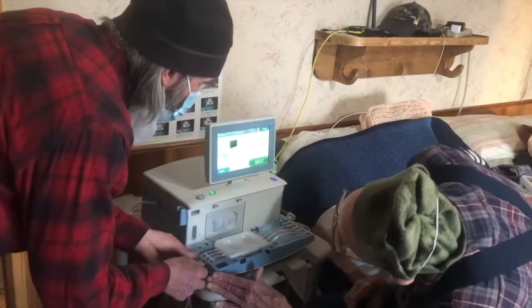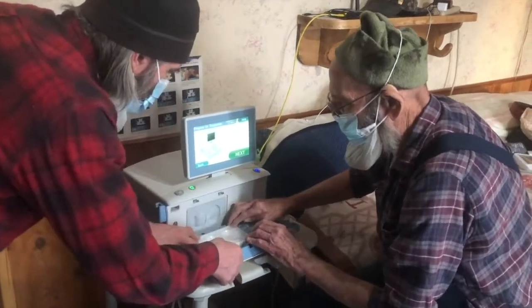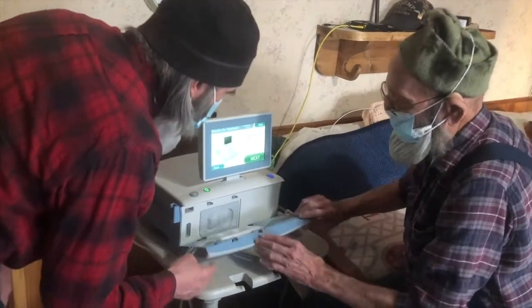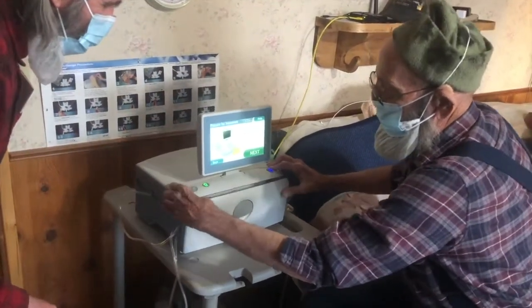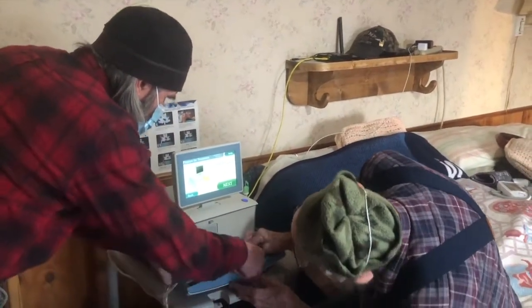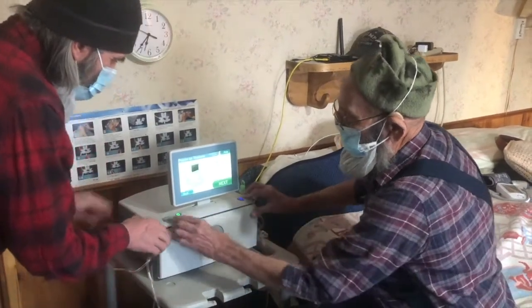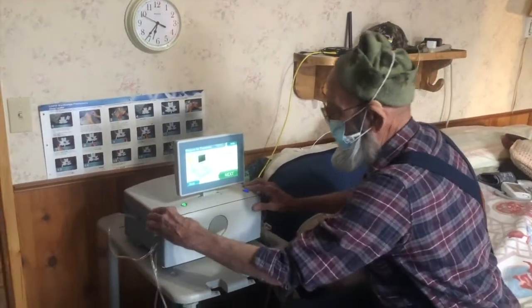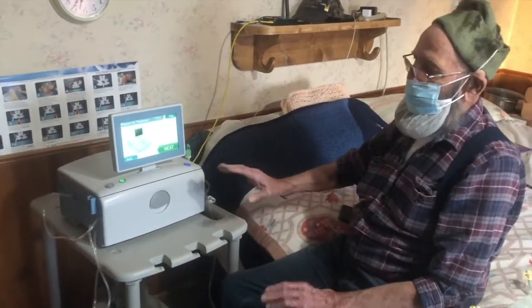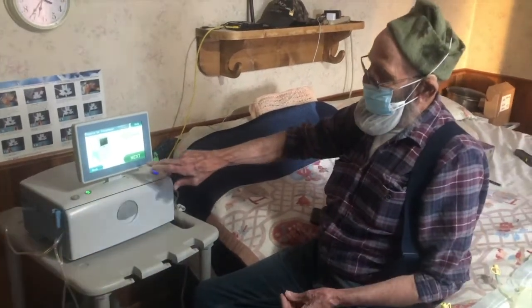No, it ain't gonna shut. And this happens. It's something else that's sticking up here. Yeah, there it went. It clicked. Now, this thing has all kinds of tests on it, so it's going to start testing in just a second.